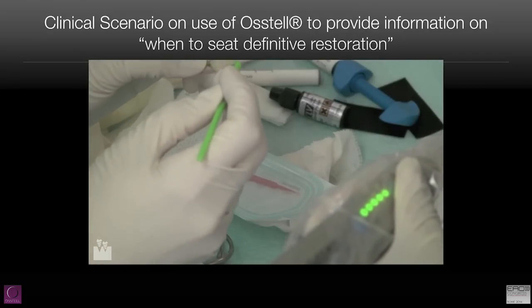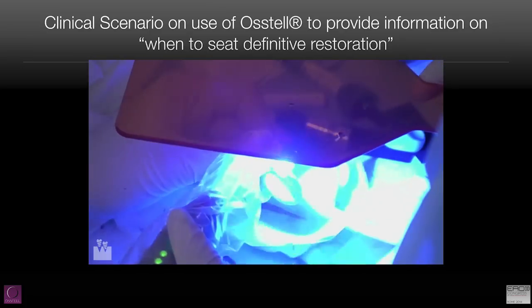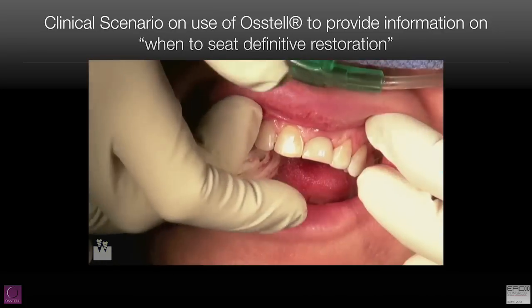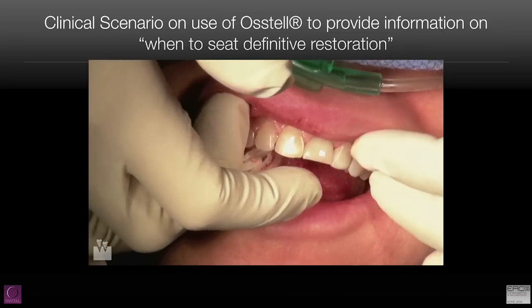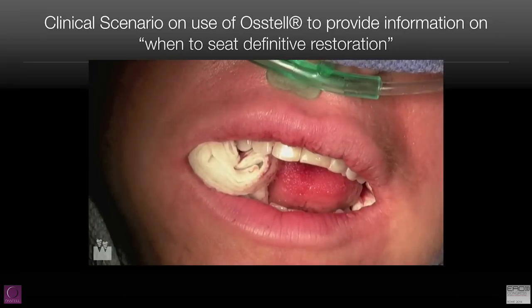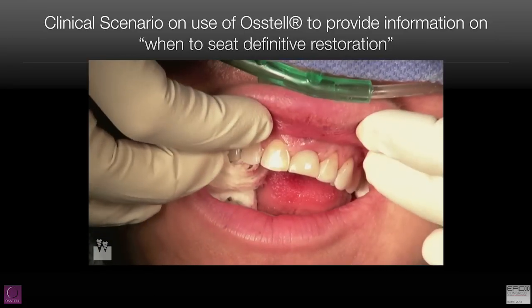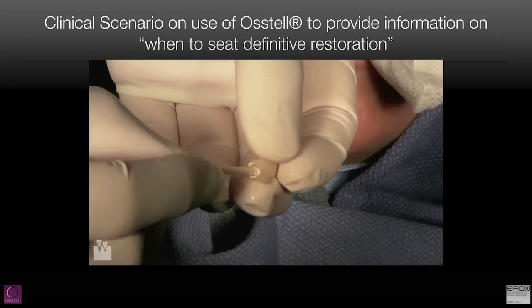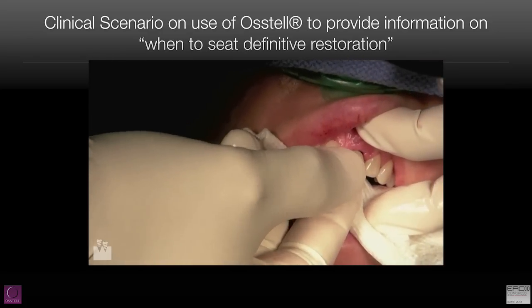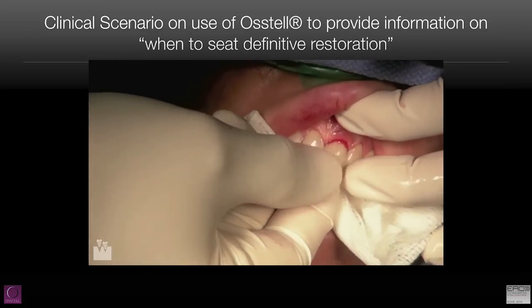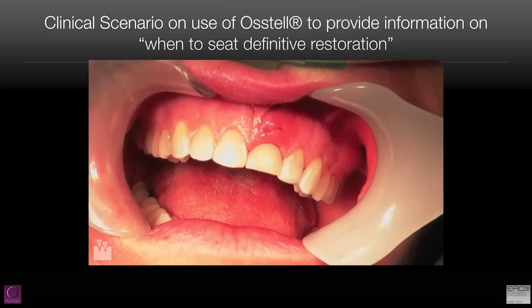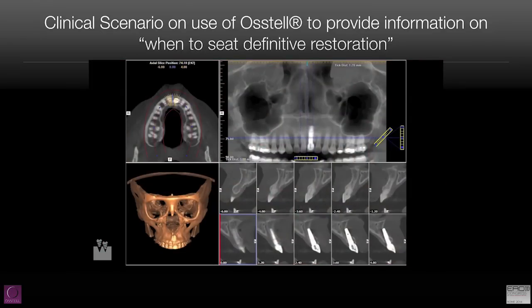This concept helps us deliver the one-abutment, one-time principle, where we can deliver the definitive prosthesis, allow our soft tissues to mold around the abutment, and provide the patient with adequate soft tissue contours. You see here, we're cementing the provisional restoration in place, taking care to avoid excess cement.